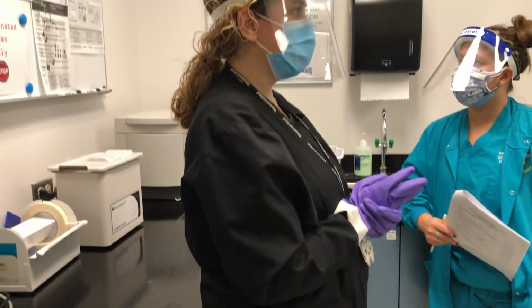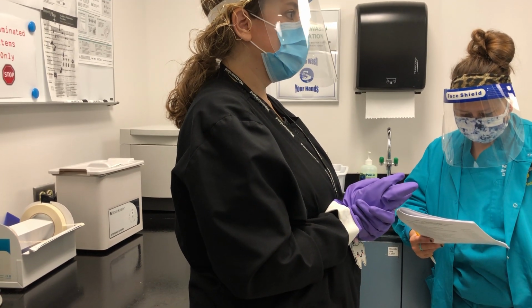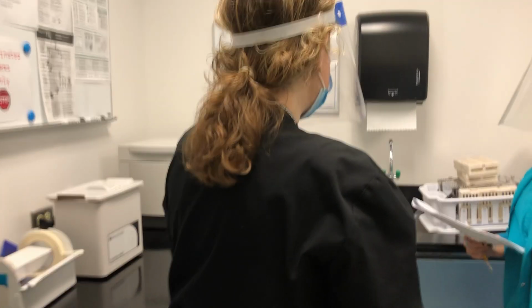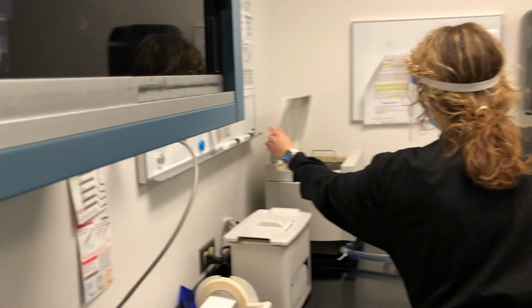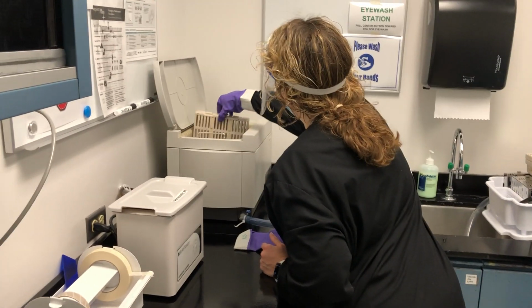Okay, so we have cleaned and lubricated the handpiece. And now you want to remove the cassette from the ultrasonic and rinse thoroughly and place it in the drainer. Okay, so once again, I'm going to lift the lid. So I'm going to take off my purple glove, go ahead and lift the lid. And then we're going to reach down in here with our gloved hand to grab the cassette.